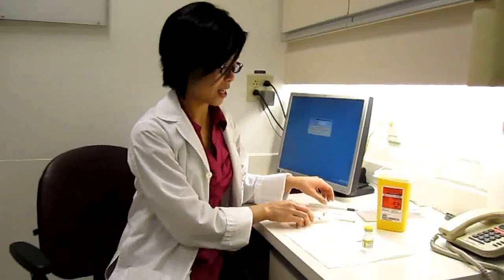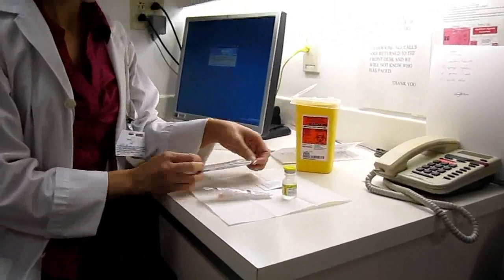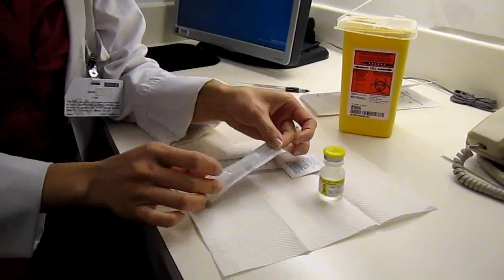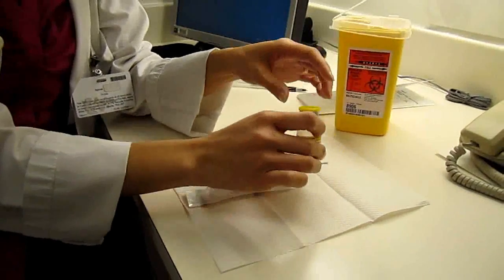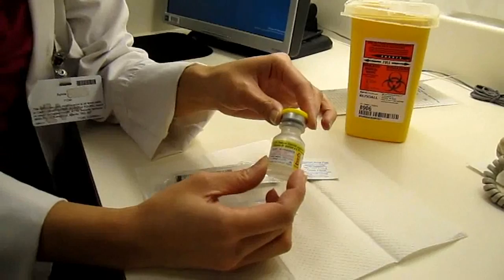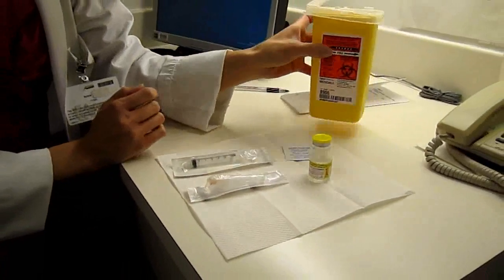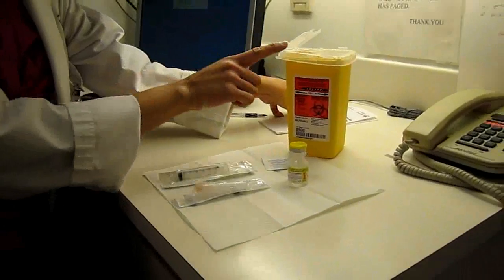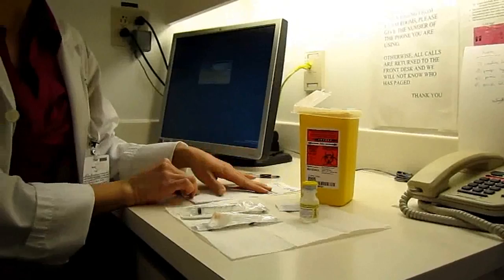We are going to start with gathering our supplies when we do methotrexate. We're going to take our syringe, we're going to take our sub-Q needle, we're going to gather our alcohol swab, and today we're going to be using a vial of normal saline, but at home you would be using a vial of your methotrexate. We will also have our sharps container to dispose of our needle and syringe and our vial of methotrexate when we are done with it, and also a log and a pen.